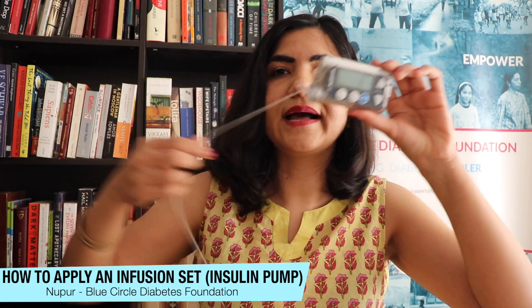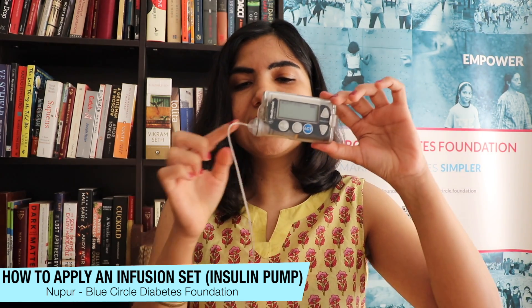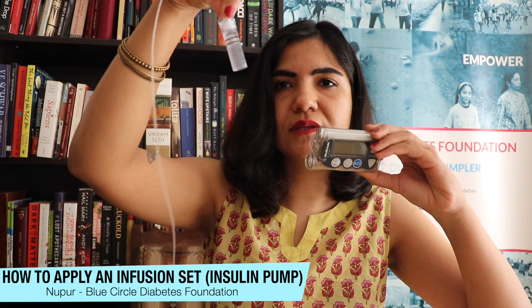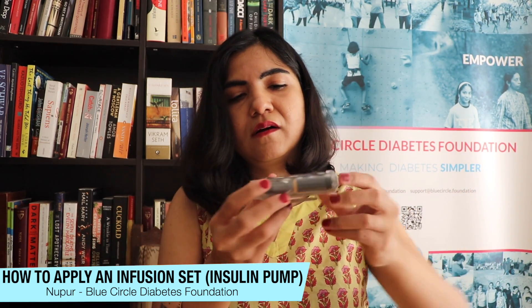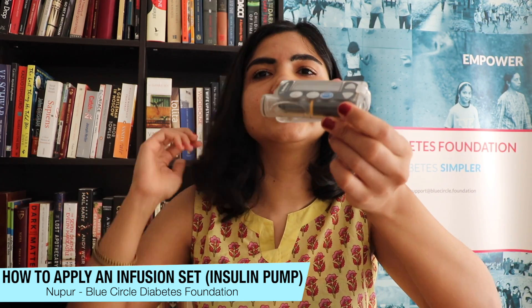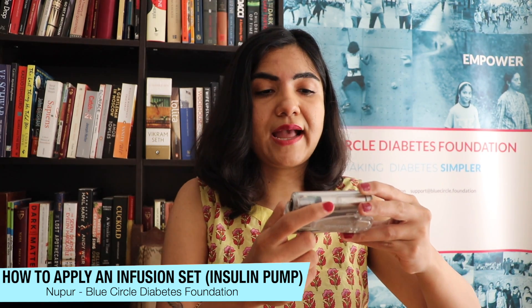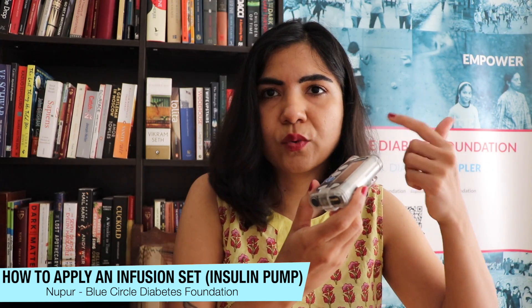This is my pump and this is the tubing from the previous one I used. On one side of the pump is your reservoir; on the other side is your battery. Take out your previous reservoir — this is what the reservoir looks like. Then you need to rewind your pump: there's a piston in here that needs to go all the way back. In my pump I find that under the prime option — you go to prime, then select rewind, and you'll hear a little mechanical whirring sound.